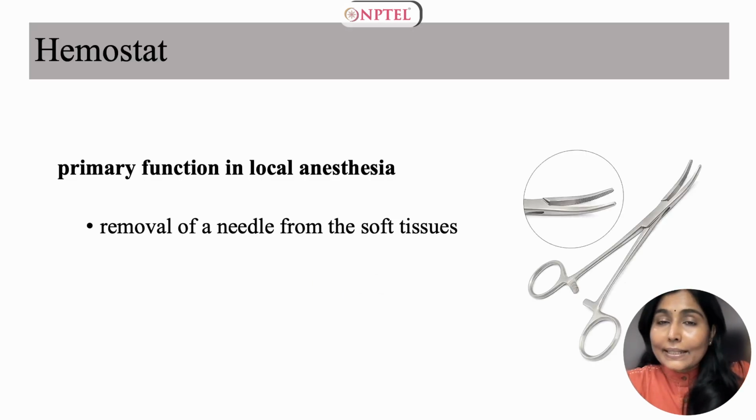Although not considered an essential element of the local anesthetic armamentarium, a hemostat or pickup forceps should be readily available at all times chairside in the dental office. Its primary function in local anesthesia is removal of a needle from the soft tissues of the mouth in the highly unlikely event the needle breaks off within the tissues.